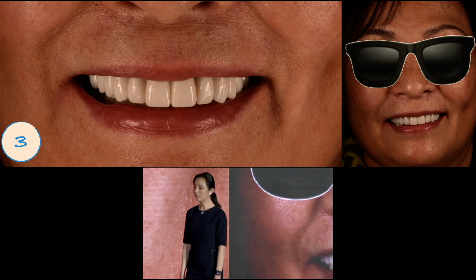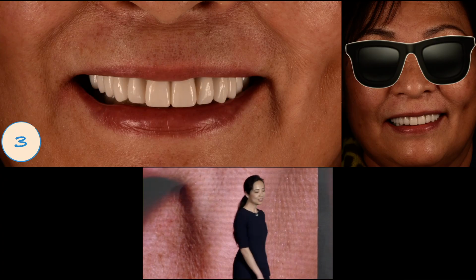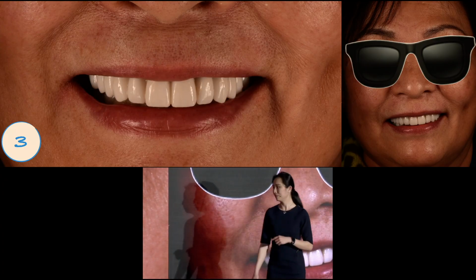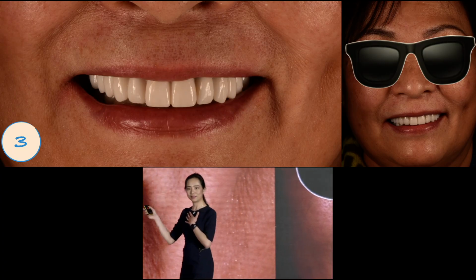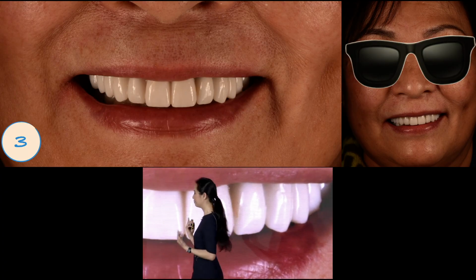This is how the patient finished. So this is, again, monolithic zirconia. This is the older version, but we still got great results. She loved it. I promise you, I did not select this shade myself. The patient really, really wanted it. It's a little bit bright, but it looks great on her.